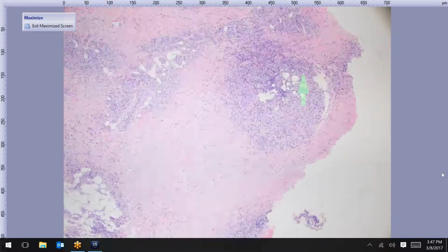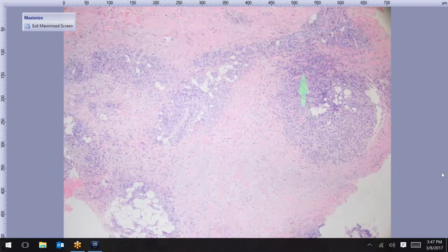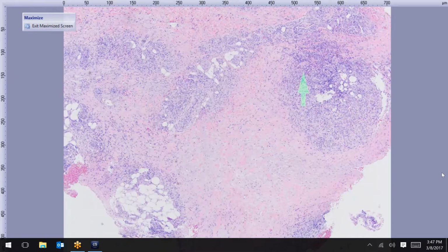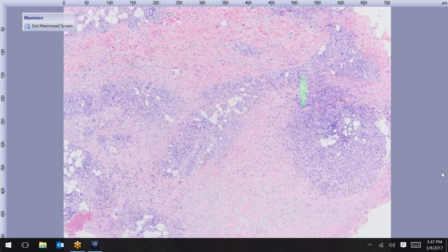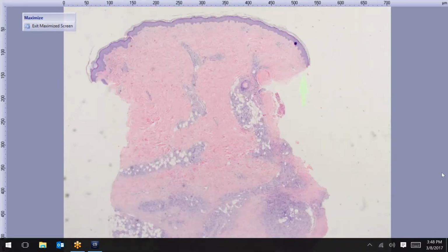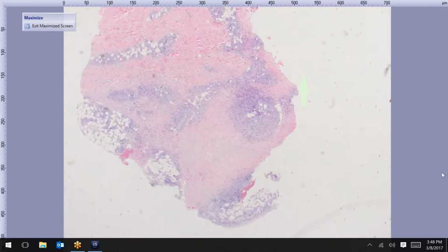Okay, we're going to do another panniculitis here. And this one we just received last week. And incidentally, from the same doctor that did the lipodermatosclerosis. She's seen a bunch of panniculitis for some reason recently. But anyway, the main pathology, Dr. Patel? A little lower power right here. As we scan on low power, you see the main pathology is down in the subcutaneous.